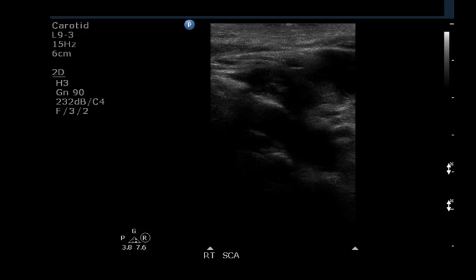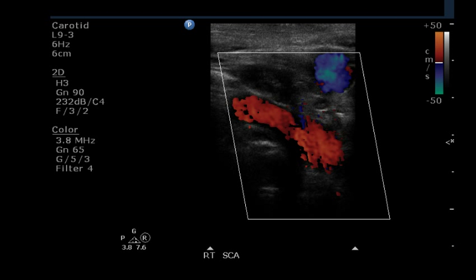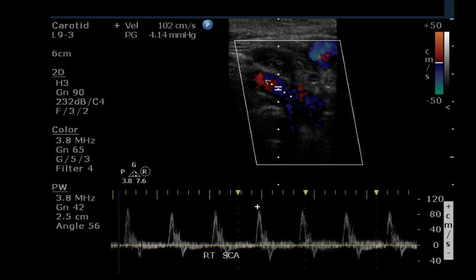This is an ultrasound examination of the carotid arteries. This is a grayscale image of the right subclavian artery. We can see the color Doppler fills this artery with color, indicating the absence or at least paucity of disease. The Doppler waveform of the right subclavian artery is normal.